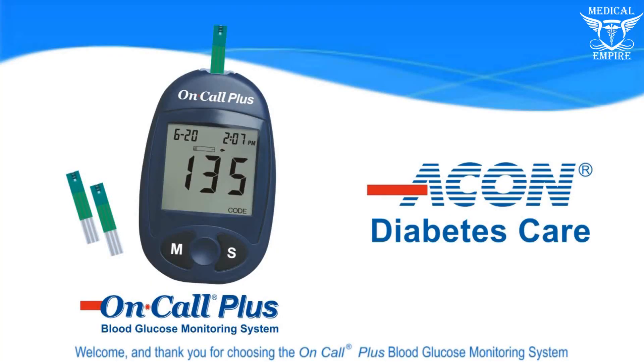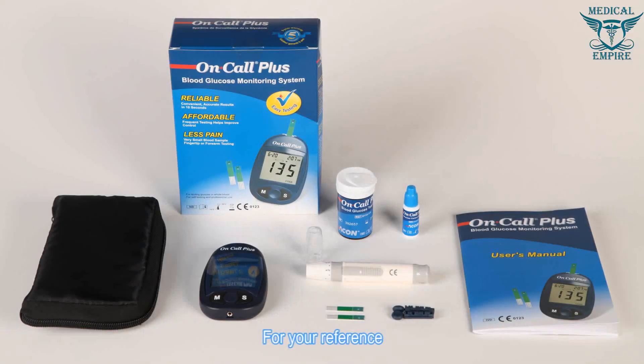Welcome and thank you for choosing the On-Call Plus blood glucose monitoring system. For your reference, the video will make you more familiar with the system.